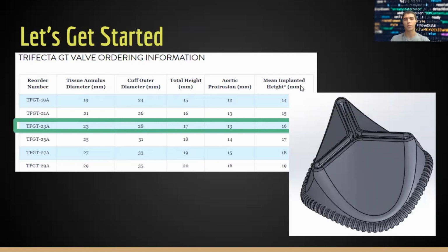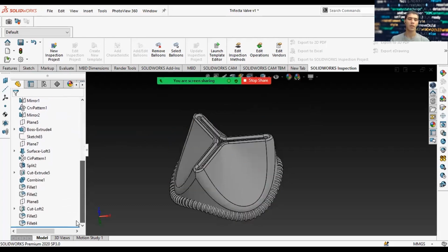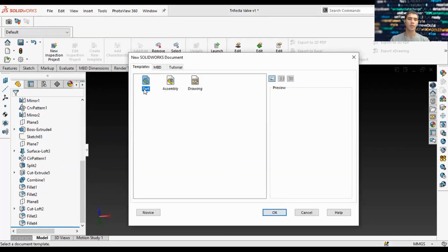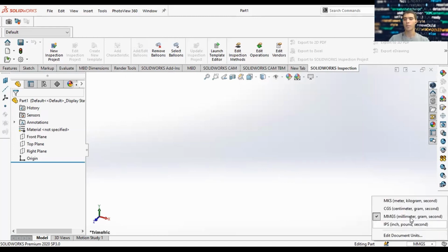So from here, let's jump over to SolidWorks. As I mentioned earlier, one feature you can use in SolidWorks is the family tree to the left. This family tree allows you to see the progression of the part as it's being made, from the earliest to the latest features or parts incorporated. The first thing you want to do is start a new part. In SolidWorks, you can create parts, assemblies, and drawings. Today we'll be focusing on parts, and usually when you have multiple parts, you make an assembly out of them. The first thing you want to do before you begin any part is to make sure your units are correct. We'll be using MMGS, which stands for millimeters, grams, seconds. That's the metric system.